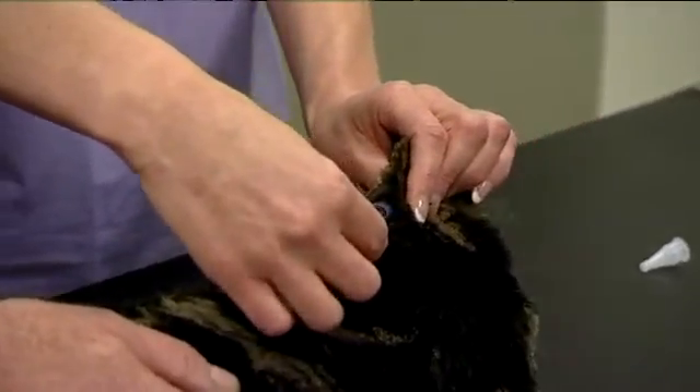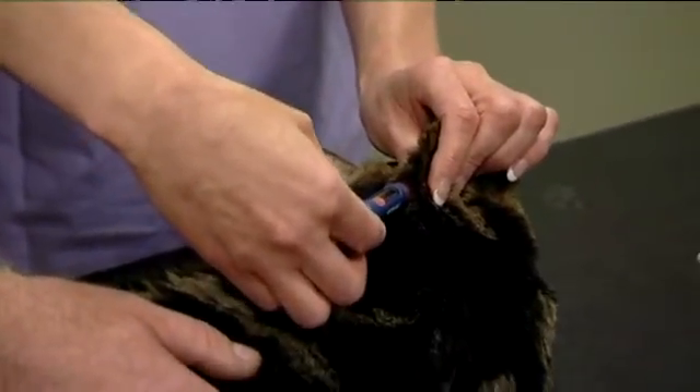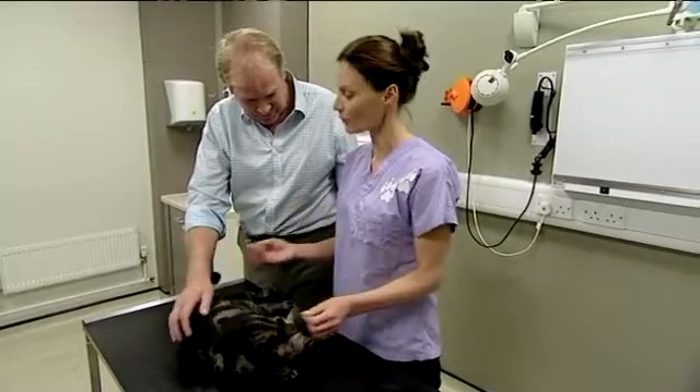Place the needle just under the skin, inject by pressing the release button, keep it in for five seconds, withdraw, and it's all done.